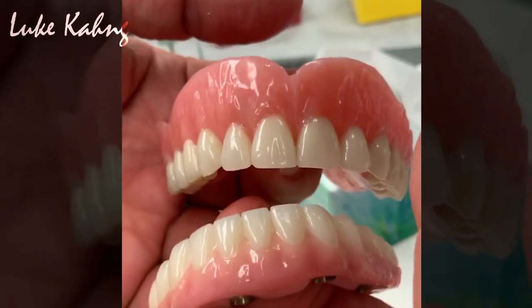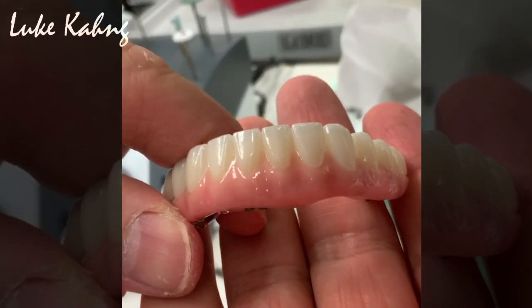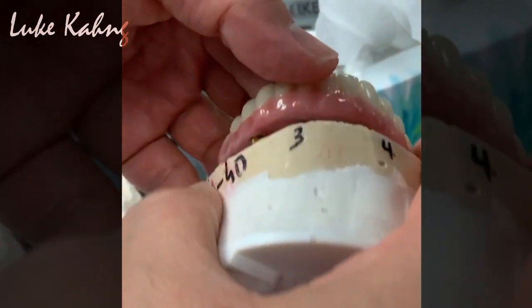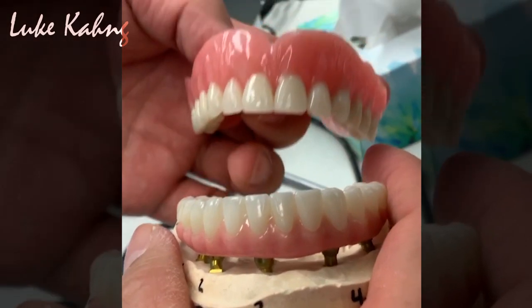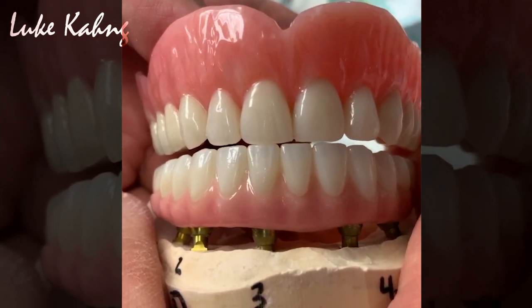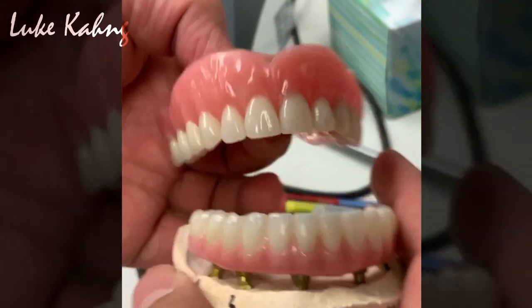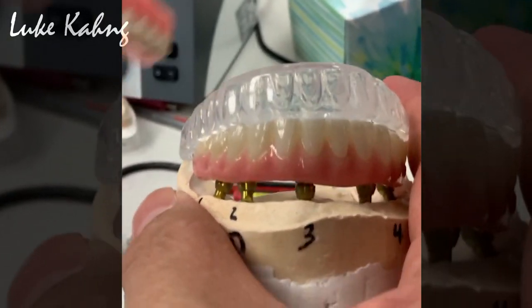Okay, so another combo case with a removable denture, and this is the zirconia case, which is monolithic on 5 implants, and we just cemented it here. This is great aesthetics, and on top of that we made great dentures to make it better aesthetically. And also we made the soft stent guard on top of that.